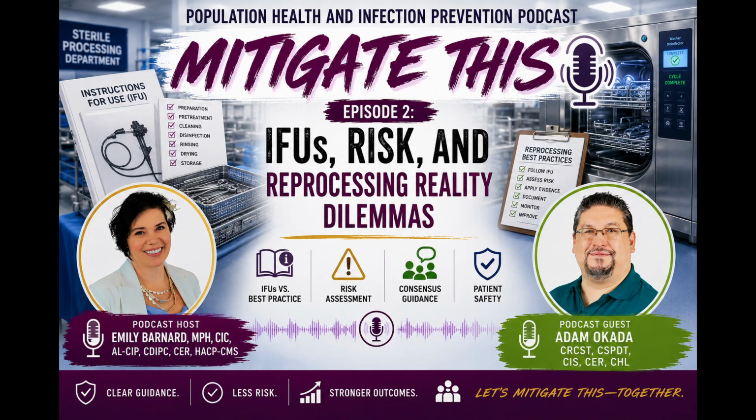And I had to sort of give him the bad news that, look, if I don't have instructions for use, I can't tell my staff how to process these. And of course, then there's the response, well, at my old facility, this wasn't an issue. And okay, well, you have to follow instructions for use. And if you don't have instructions for these instruments that you've customized, we can't process them. So we had to go to a third party to actually have these legitimately done, to get instructions for use on these customized instruments.